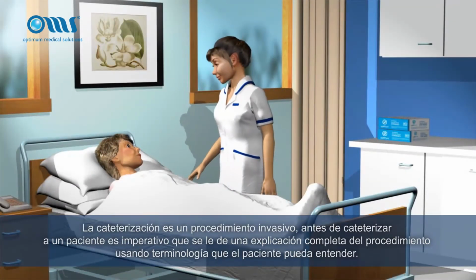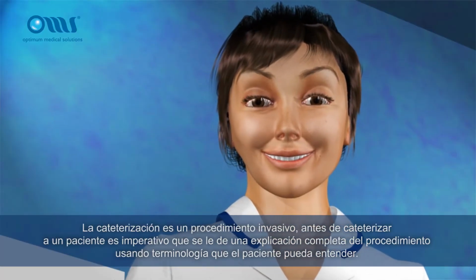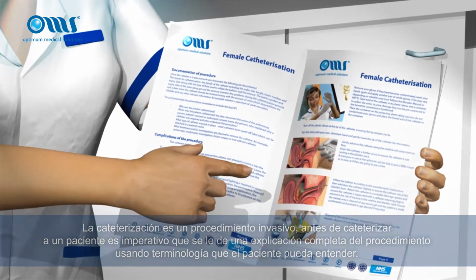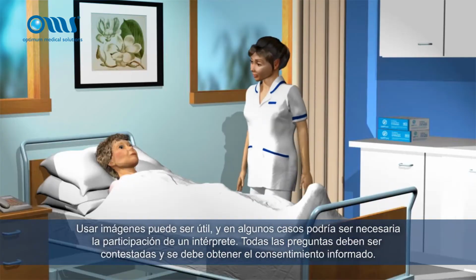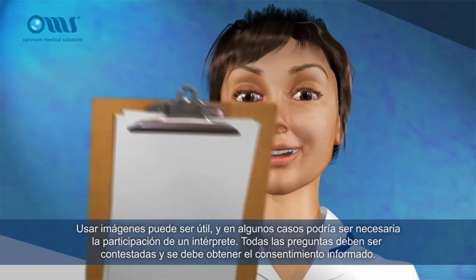Catheterisation is an invasive procedure. Prior to catheterising a patient, it is imperative that a full explanation of the procedure is provided, using terminology which the patient can understand. Using pictures can be helpful, and if necessary, an interpreter may need to be involved. Any questions must be answered and informed consent gained. A clear explanation and reassurance can help to reduce anxiety and enable a more comfortable insertion of the catheter.